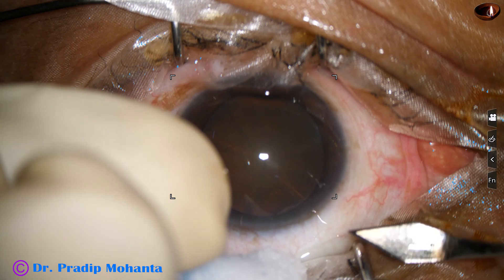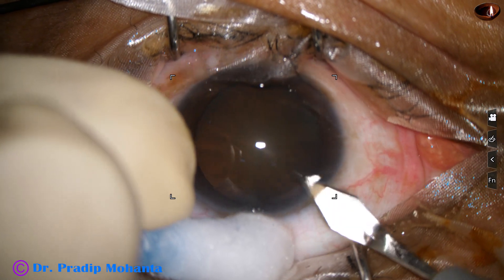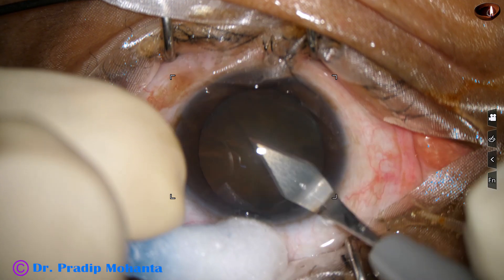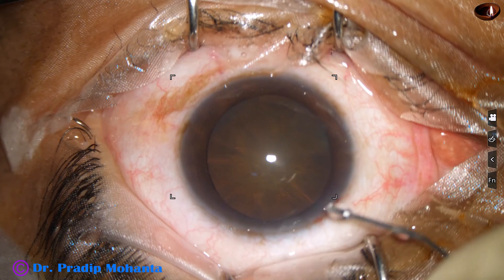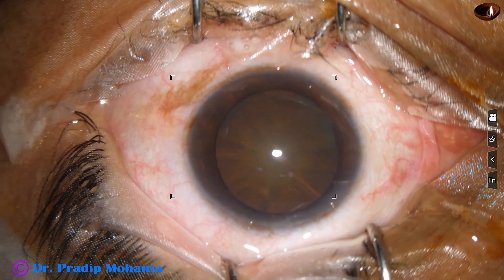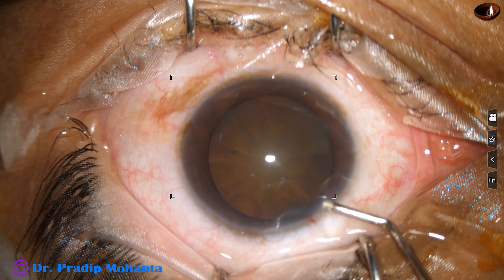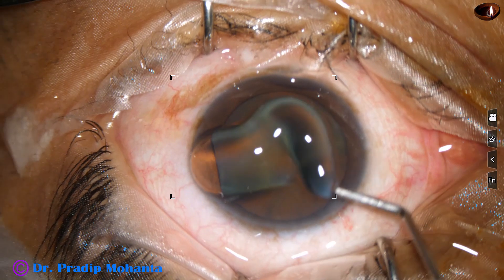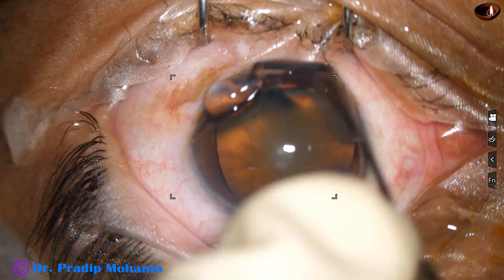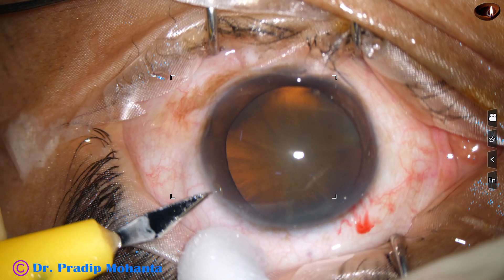This is the main incision with a 2.8 mm steel keratome at around 11 o'clock. This is phenocaine because the patient is under topical anesthesia. And this is visco, filling up the anterior chamber, and it is applied over the corneal epithelium for better visibility.